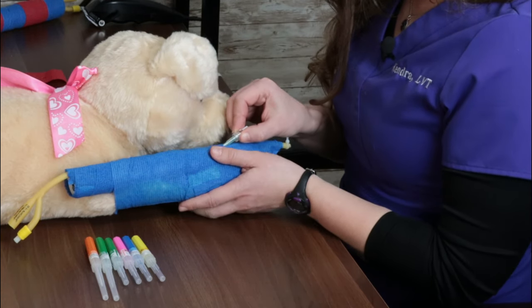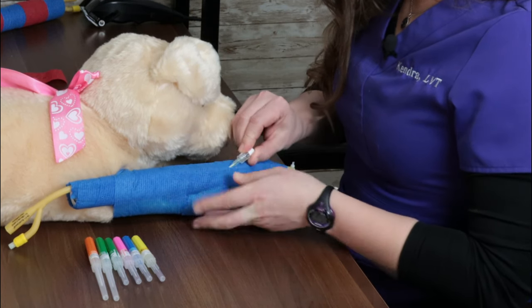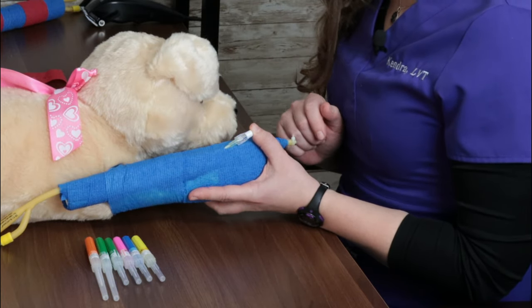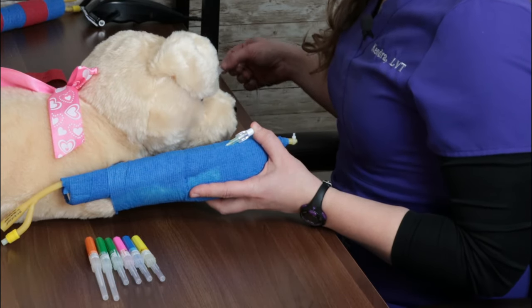We're gonna place our cap on. And it's really important that at this point, we still restrain the patient with our non-dominant hand and keep a thumb on our cap so that if our patient flails, our catheter is gonna stay in place.